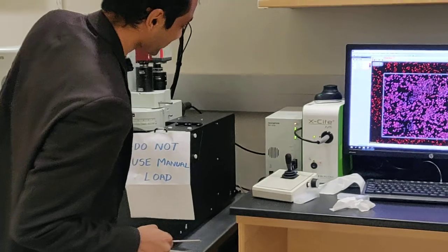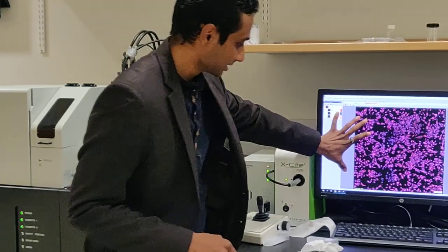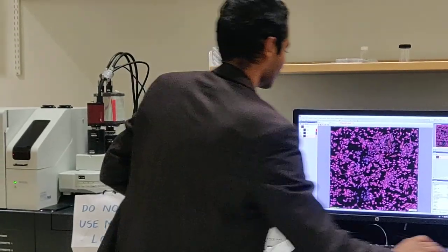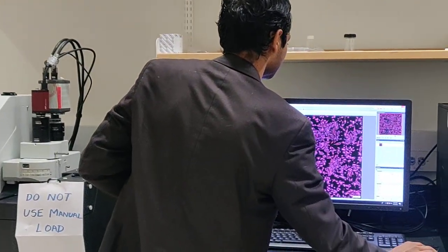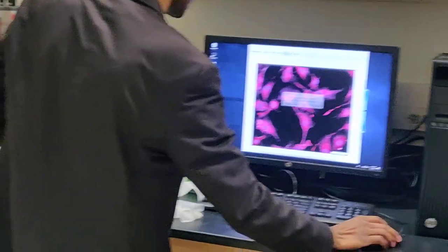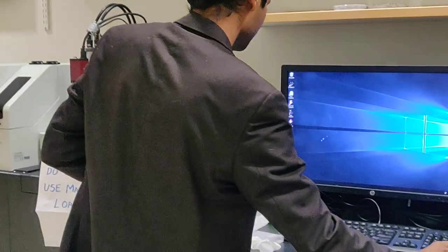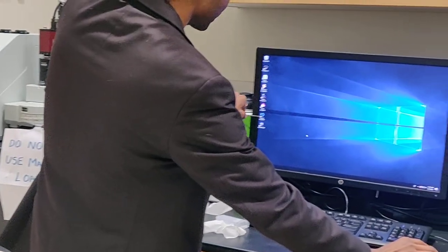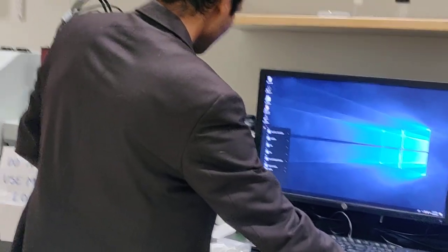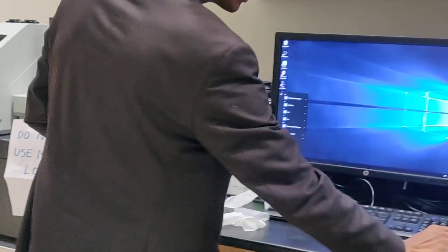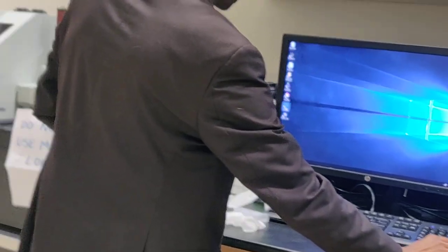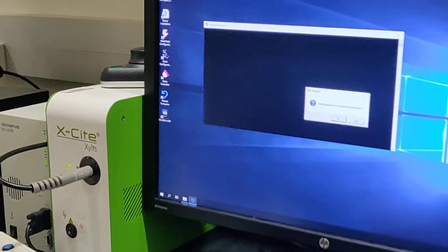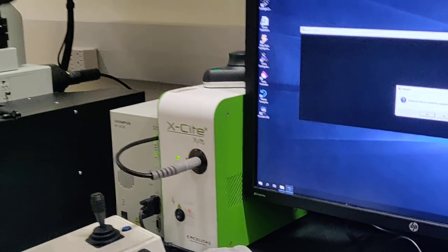The extraction is almost done — here is the new image that has been pulled out. To open a VSI file in Fiji, you need a plugin; it can be done but will be a huge file that could crash your computer. CellSens software works pretty well for analysis. You can also double-click and restart from within the scheduler window without logging off.